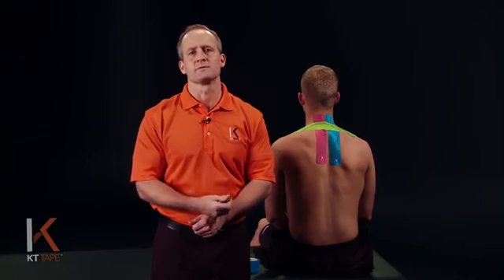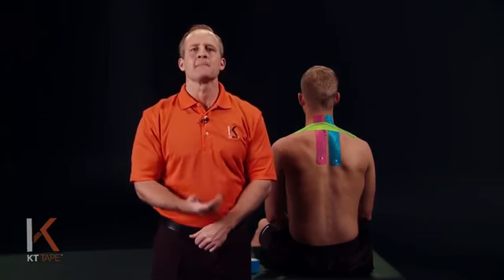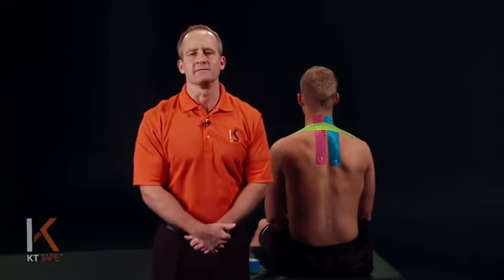Clean the skin very well. Remove any oils or lotions you may have on. Be careful with taking clothing on or off, as this may roll the tape. Try not to tape into the hairline. This may cause a little pulling of the hair if turning your head. Also, you can use beige KT tape if you don't want the application to be that visible.